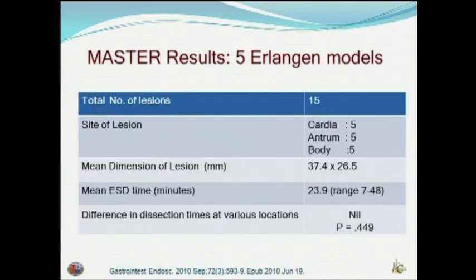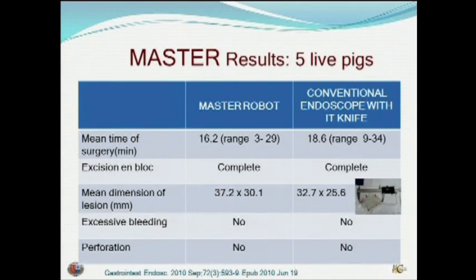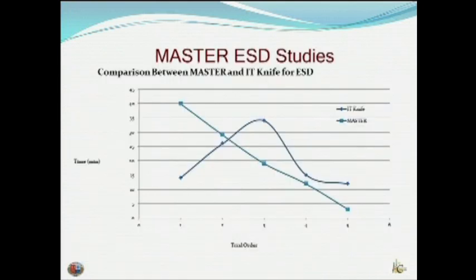We did 3 lesions on each of the 5 Erlangen models, one on the cardia, antrum, and body. We found there was no difference in dissection times at the various locations. Comparing the performance of the master robot with the conventional endoscopic IT knife, the mean surgical time, en bloc excision, and mean dimension were similar. There was no excessive bleeding or perforation. But going on to the learning curve, the master had a learning curve, and soon it took over from the IT knife.